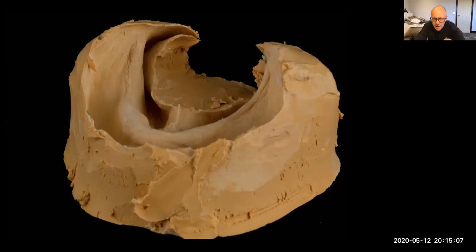The primary impressions are like mapping out the topography of where we want to position the special tray. So the primary impressions are overextended, and the primary impressions are not border molded. This is really important. We only border mold the definitive impressions.